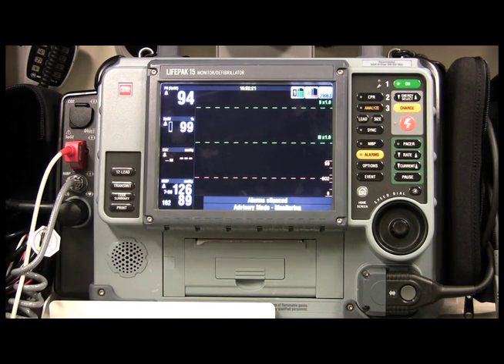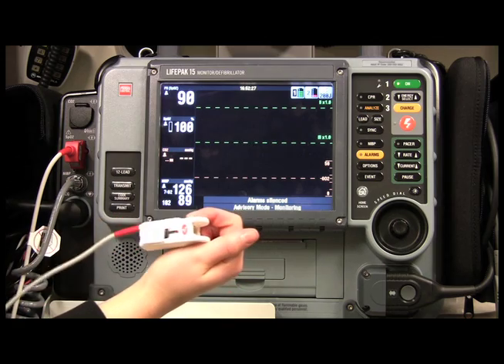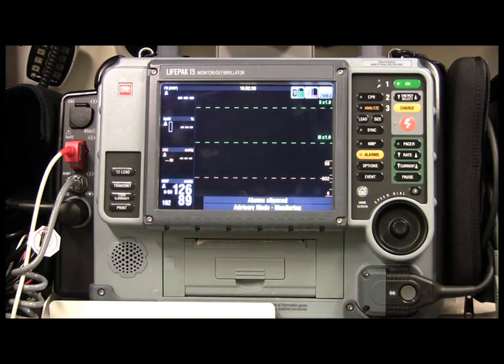Now I'm going to go ahead and disconnect the pulse oximetry and the blood pressure cuff.